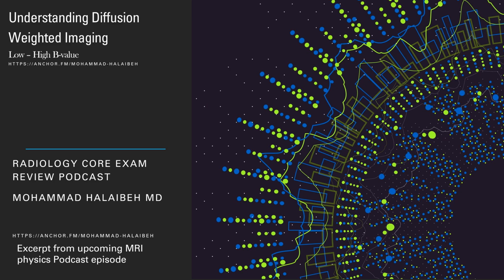Given that we're interested in the dark signal on the ADC map, we said to get the diffusion weighted image, we have to invert the ADC map. So anything dark on the ADC map will be bright, and anything bright will be dark, and that's how we get the diffusion weighted images.